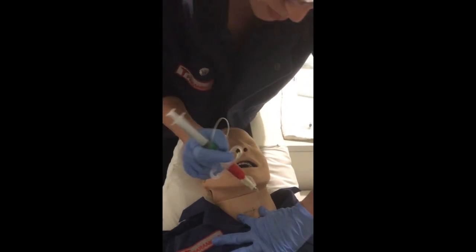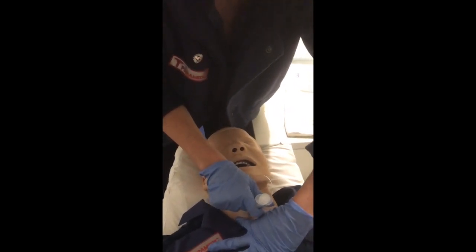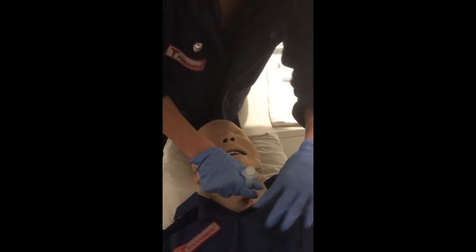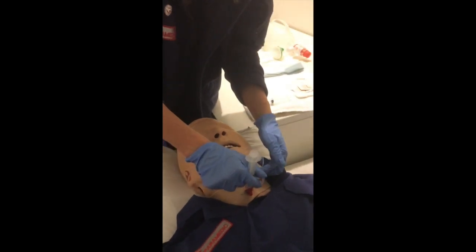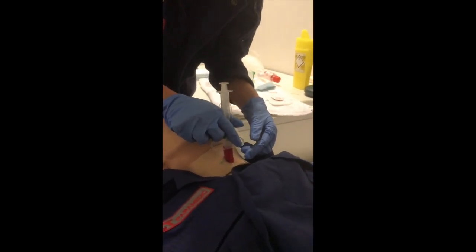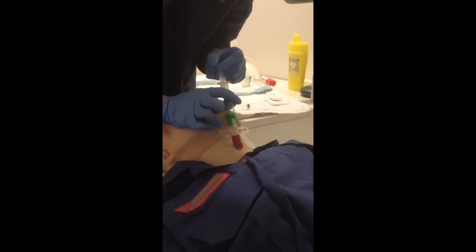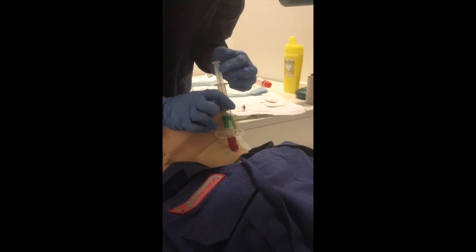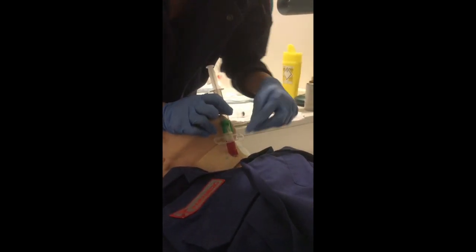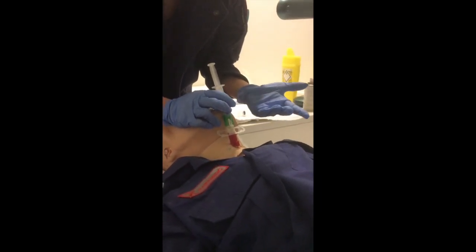Again, in my dominant hand, we're going to attempt to insert at 90 degrees, considering this may need to be quite firm pressure, down to the red stopper, which is in place to ideally prevent you from penetrating the posterior tracheal wall. At this point, you would then tilt back to a 60-degree angle, and we're going to aspirate. In some services, they actually fill this syringe with water so that you would see the air bubbles as opposed to having to listen for them. Providing that you are able to aspirate air, then you are believed to be in the trachea.